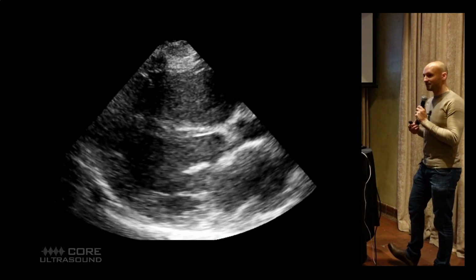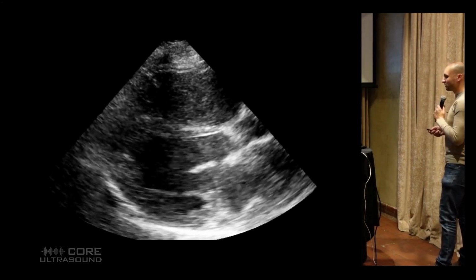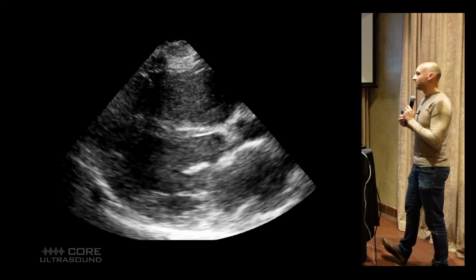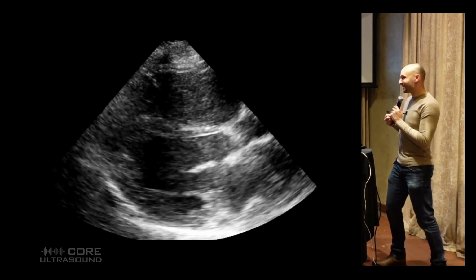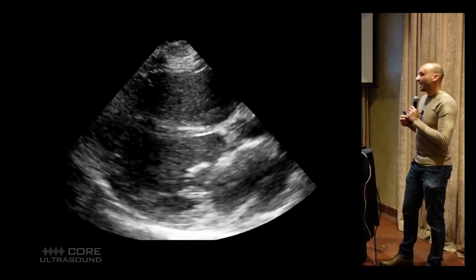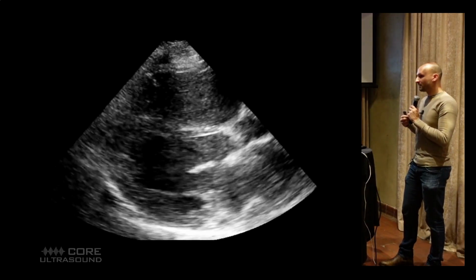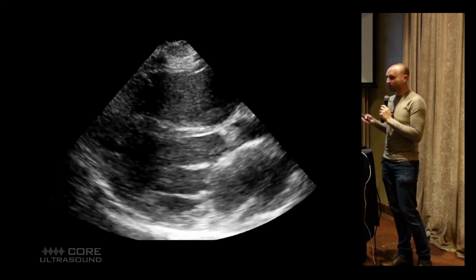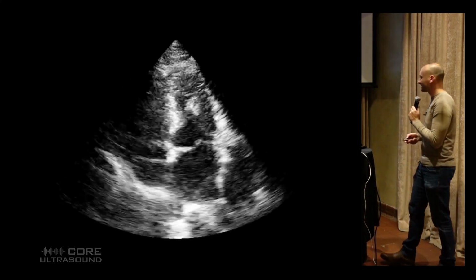Call shenanigans, right? So resume compressions. Now a question: let's say that you see this and it's been 4 seconds. Do we need to wait 10 seconds? No, because even if there happens to be a little pulse at some point, the patient would still have horrible bradycardia and it still needs to resume compression. So if you see this, you do not need to wait 10 seconds.